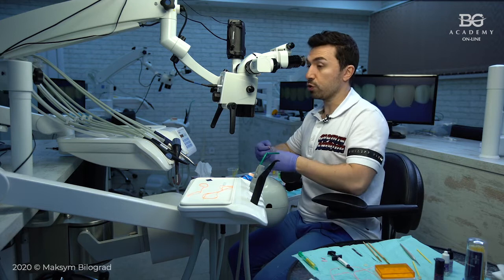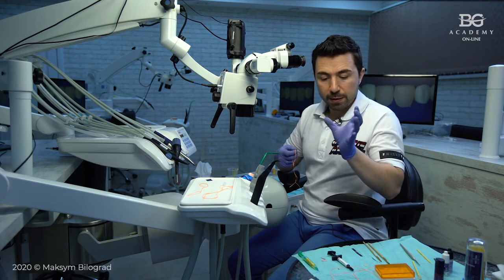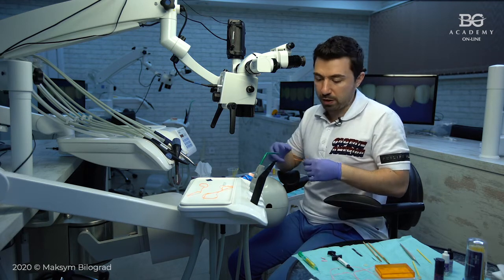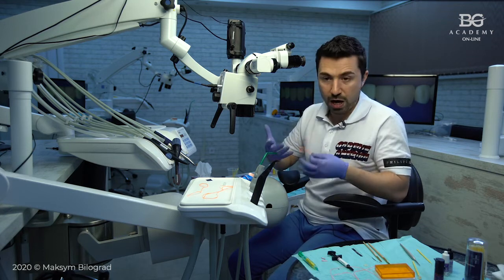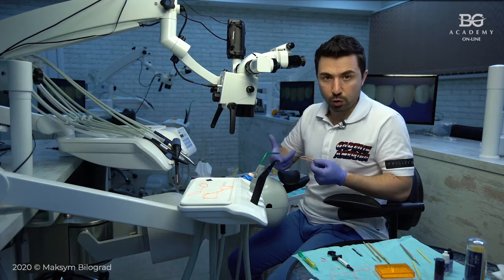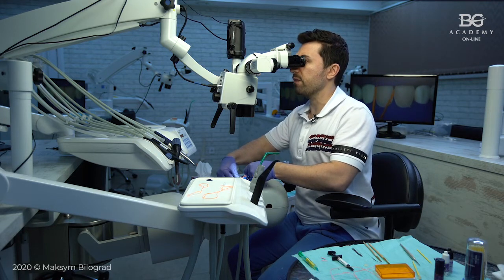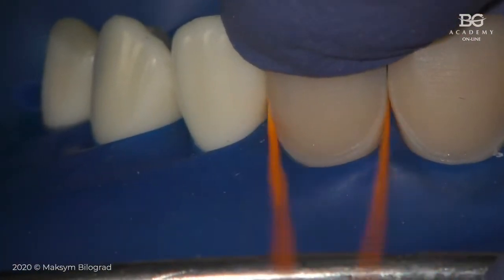Personally, I prefer to use floss ties if I can, because if you put a clamp, it has the arch, and the arch sometimes is a problematic part when you have to work around the tooth with a brush or with floss or with a scalpel blade, and this bar is always in your way. With floss ties this never happens, because you have a lot of space around the tooth. So if you can use floss, do this.